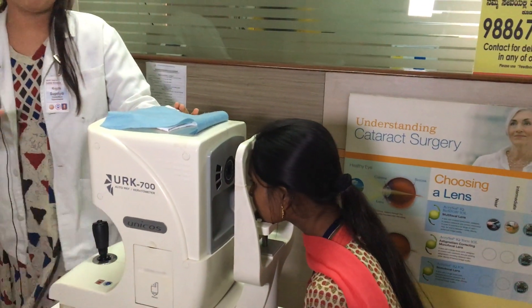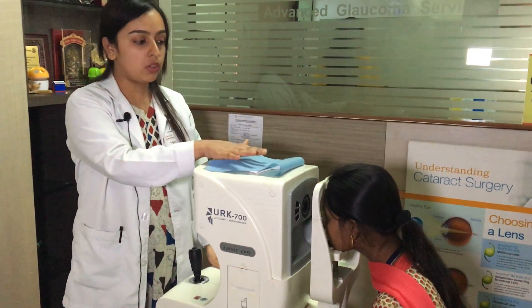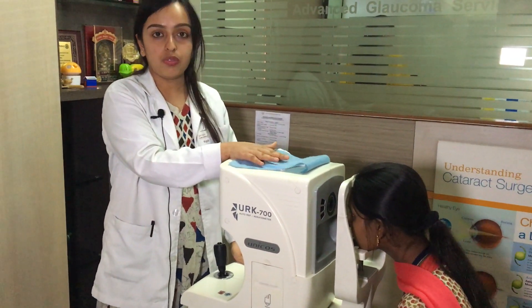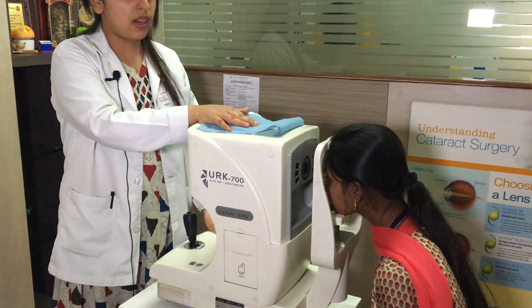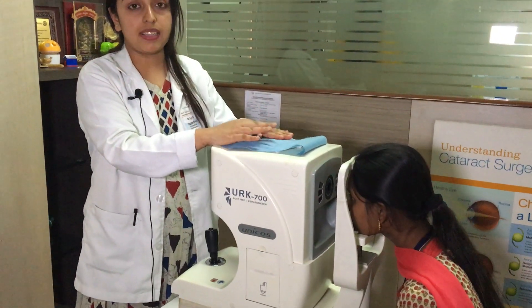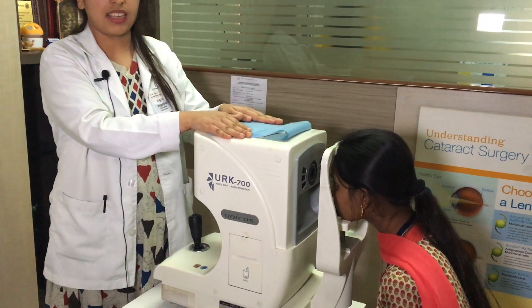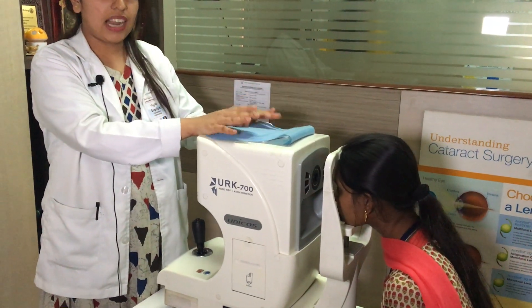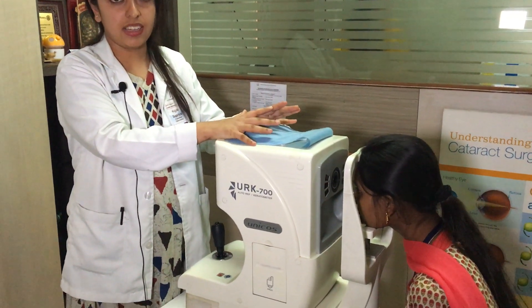The chin rest — the patient will be focused on this distance. When you focus on this distance, the eye muscles are relaxed. It will be completely relaxed, and if we relax, we will get an accurate power reading.